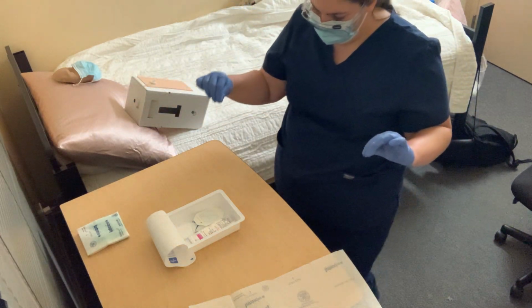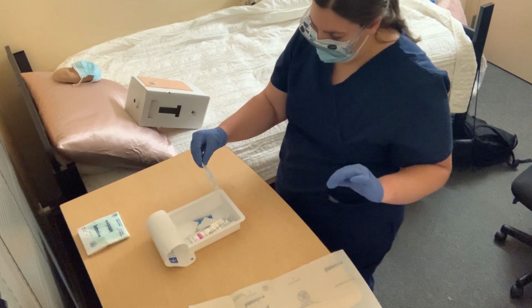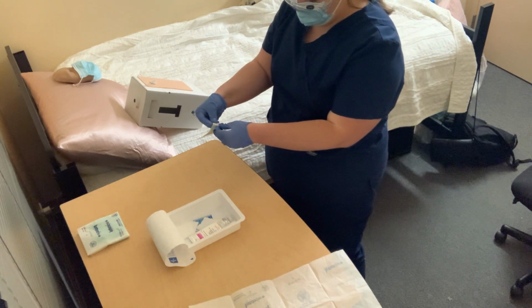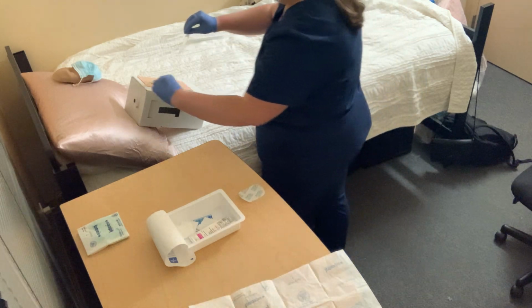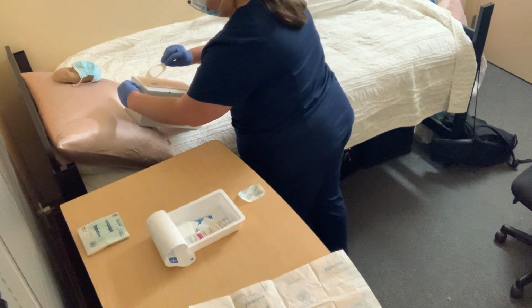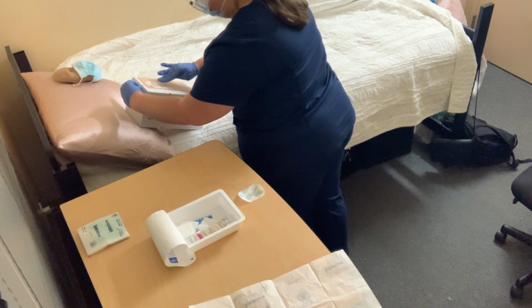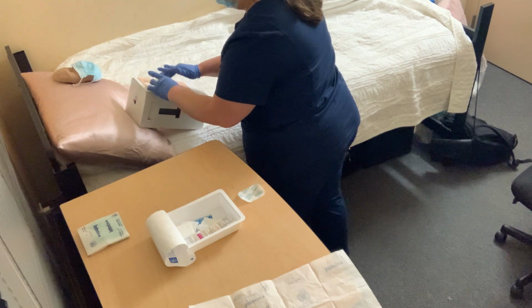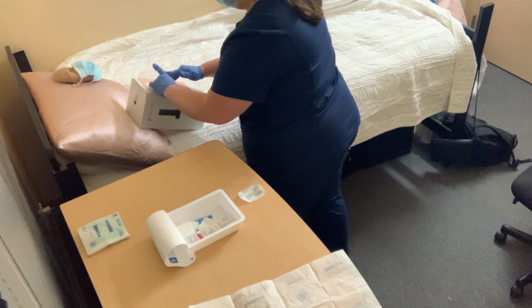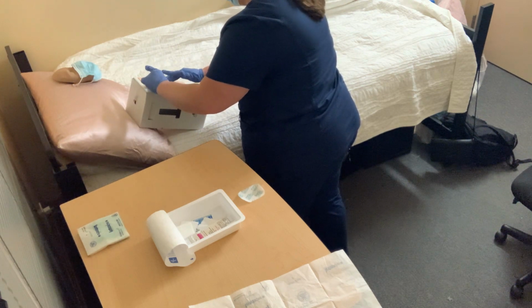I'm going to go back into the tray with my right hand to grab the tegaderm, and I'm going to use my left hand to take off the backing of the tegaderm. And then I'm going to place the tegaderm over the insertion site. And now that the bio patch is covered, I can go ahead and use both hands to get any air bubbles out. Are you doing all right, Mr. Smith? Okay, perfect. I'm almost done on my end.